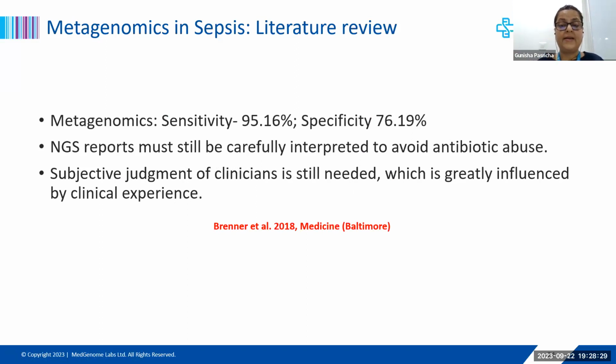I'll take you through why it could be polymicrobial, because NGS is a very sensitive technique and will pick up all the microbes while collecting blood, or the microbes present in the kits and the centrifuge tube, and how algorithms and cutoffs are required. Guidelines are actually needed to define how these reports could be generated and interpreted.